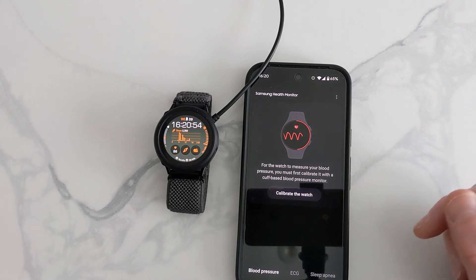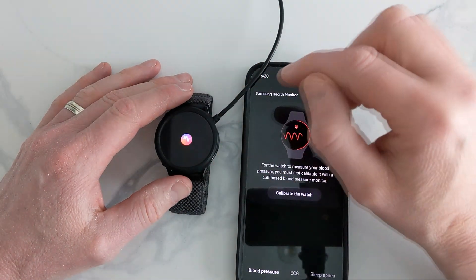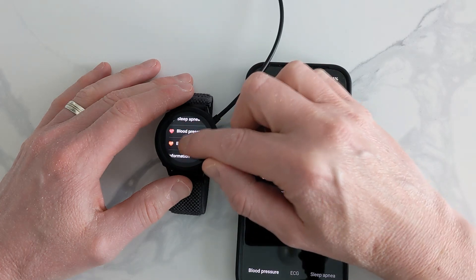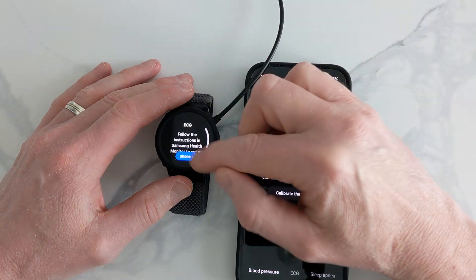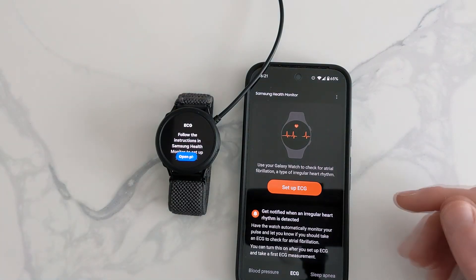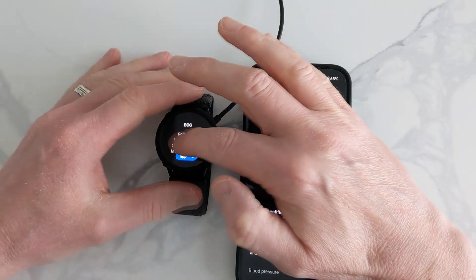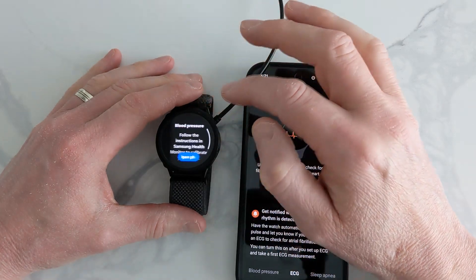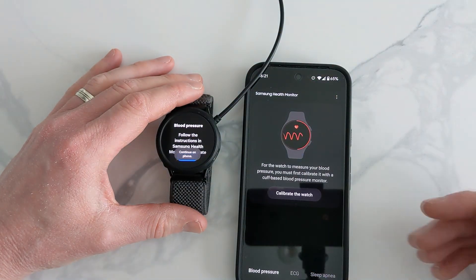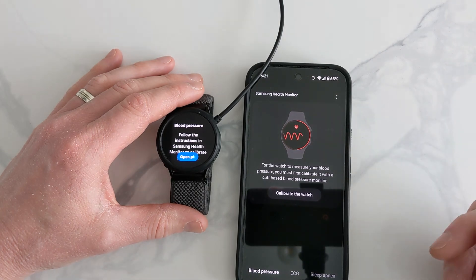I'll show you on the watch what happens now. Previously it took us to the Samsung Store, but now when I press it, it opens in the app itself. Same with the blood pressure — click on that and it takes us straight to it. So it all works, but you would need to calibrate it all up.